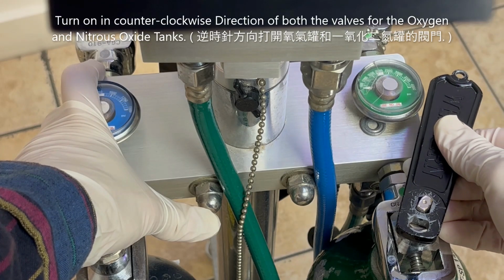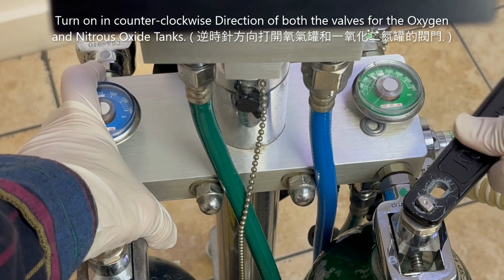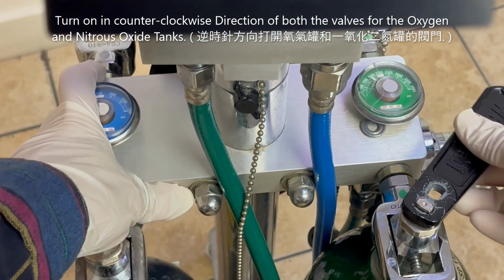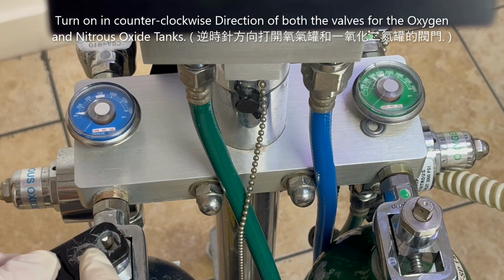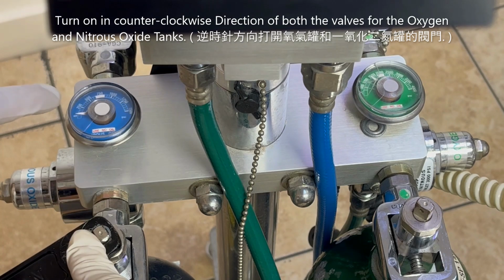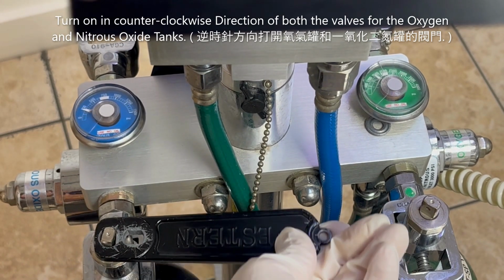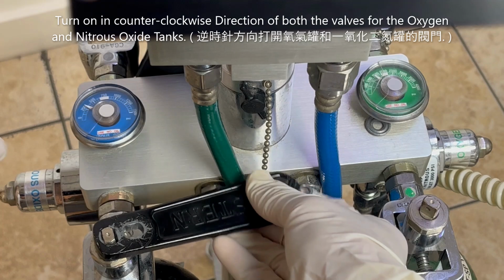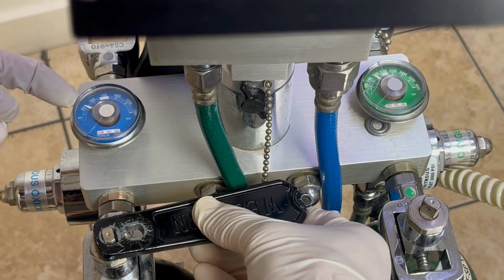In the counterclockwise position. You can see the needle goes up. Then the next way we turn the laughing gas on, the nitrous oxide, counterclockwise, and keep an eye on the nitrous oxide gauge. This tank has been used, that's why the reading is not full tank. It was used for a patient before.